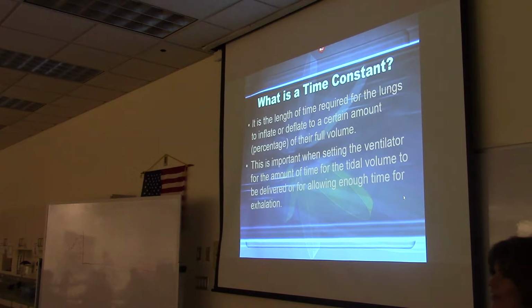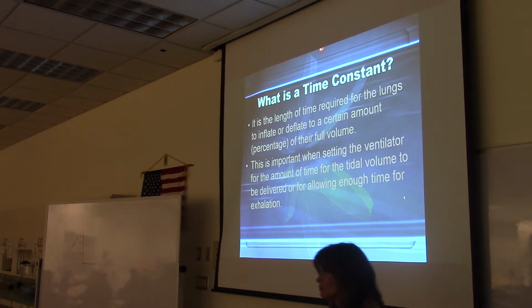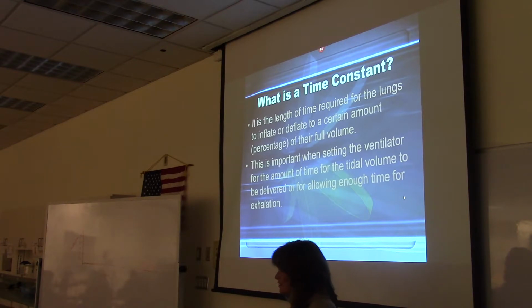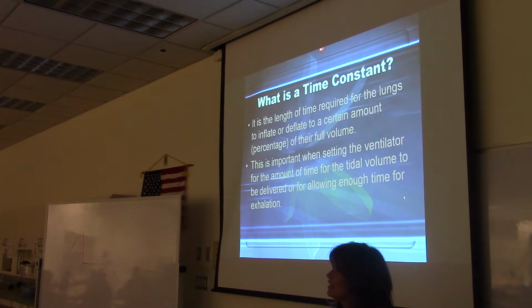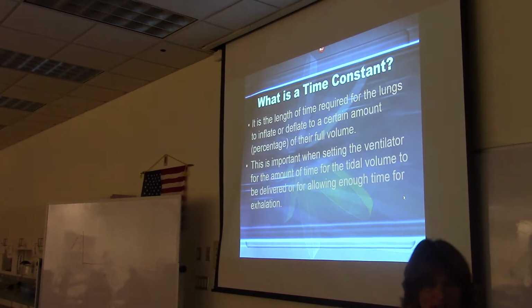So when you're putting a volume of air into a patient's lungs, you can put it in real slow, or you can put it in fast, or you can put it in between. And when they exhale, it could take a little bit of time, it could take a lot of time. That's where we're going with this information.